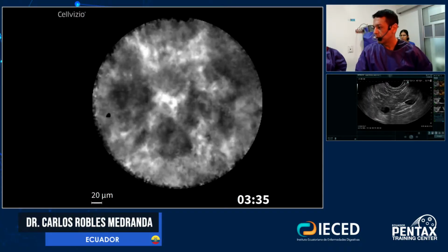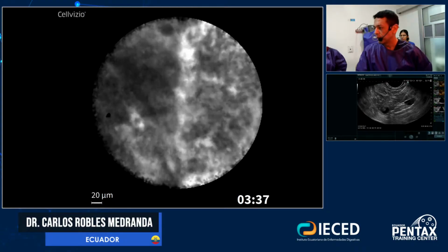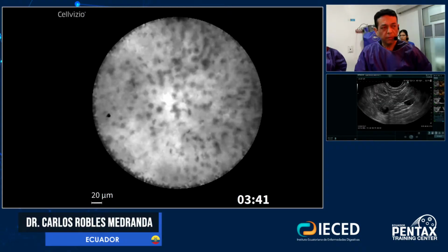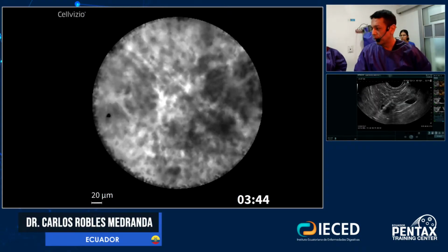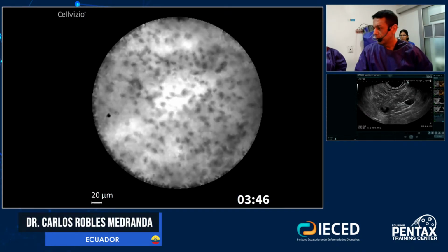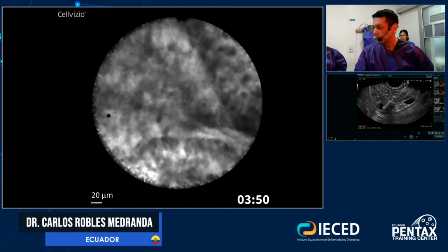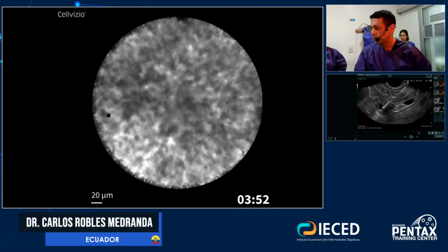So I'm very curious to see this histopathology, but to my opinion there is probably a mixed lesion here, because I am in other area from the beginning. Well, it was difficult. There were some dark clumps that could be a misunderstanding because of the blood cells.